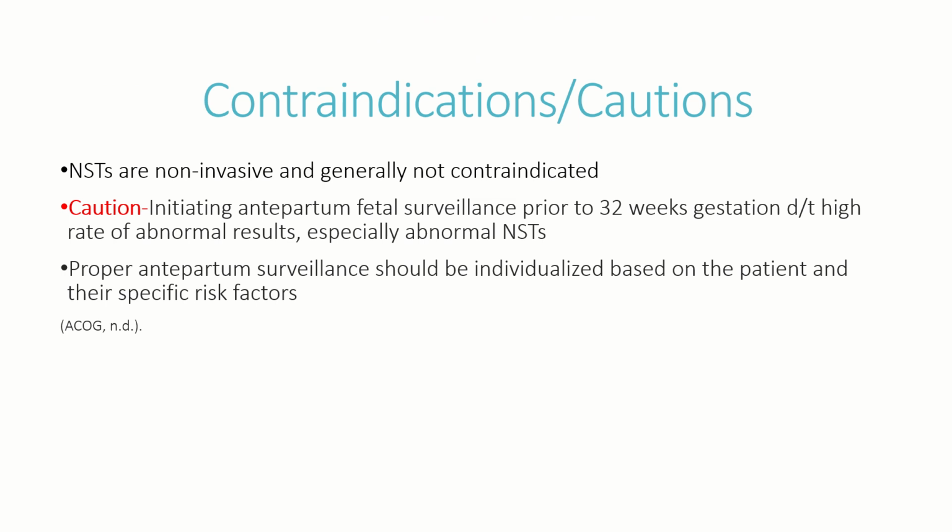Non-stress tests are non-invasive, so they're generally not contraindicated. However, caution should be taken initiating antepartum fetal surveillance prior to 32 weeks gestation due to a high rate of false abnormal results. Any false abnormal result can cause unnecessary interventions to take place. Therefore, proper antepartum surveillance should be individualized based on the patient's indication, risk factors, and gestational age.